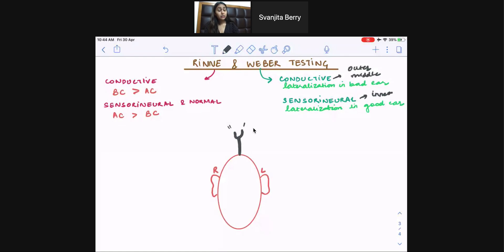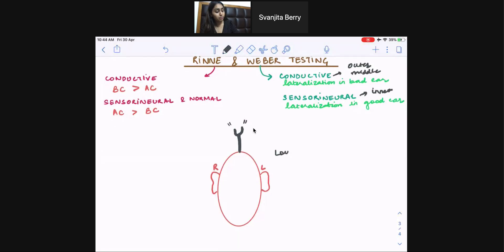And you keep it midline on the patient's skull. And you ask the patient if they can hear the sound equally in both ears, which is something a normal patient should say yes, respond yes to. Now, this patient said, no doc, I actually hear it louder in my left ear.